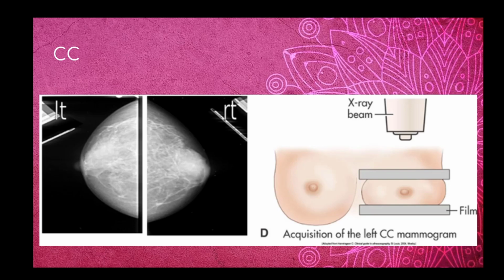I think it's going to be important for you to remember all those tools that we have available to us as sonographers. Remember that there's other imaging modalities. Be aware of the procedures that we are involved in, and first and foremost important, know how to label your location on the breast, the difference between antiradial and radial, and then sagittal and transverse, and how to position a patient appropriately, what transducer to use, and then you also really need to be able to recognize the breast layer tissues by ultrasound.